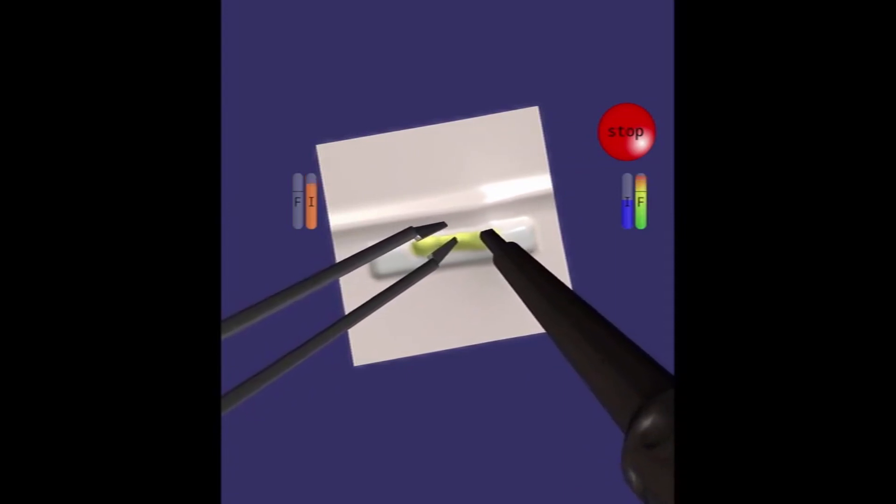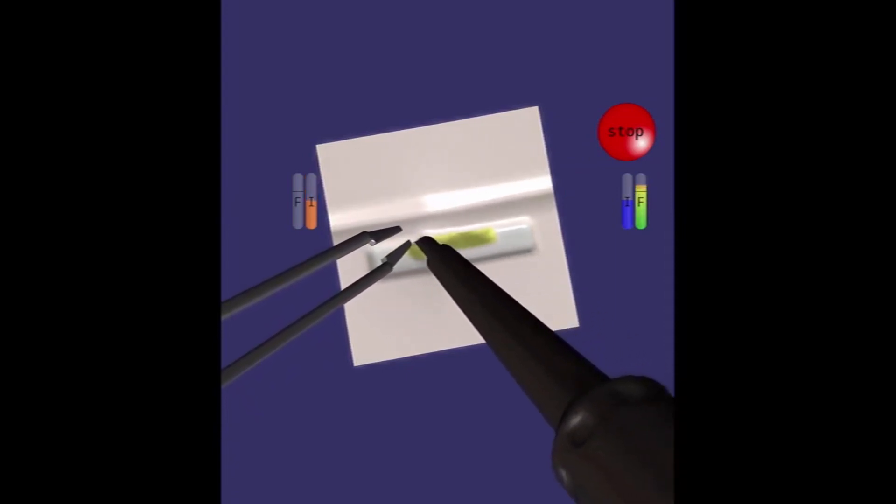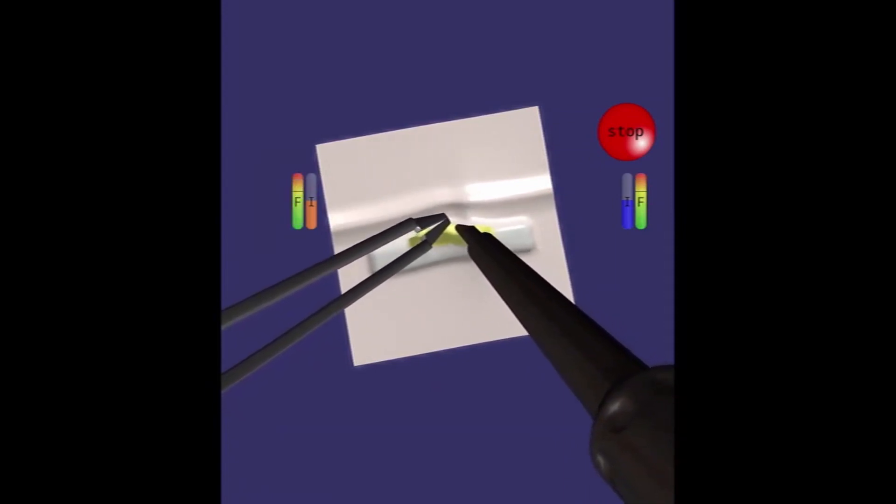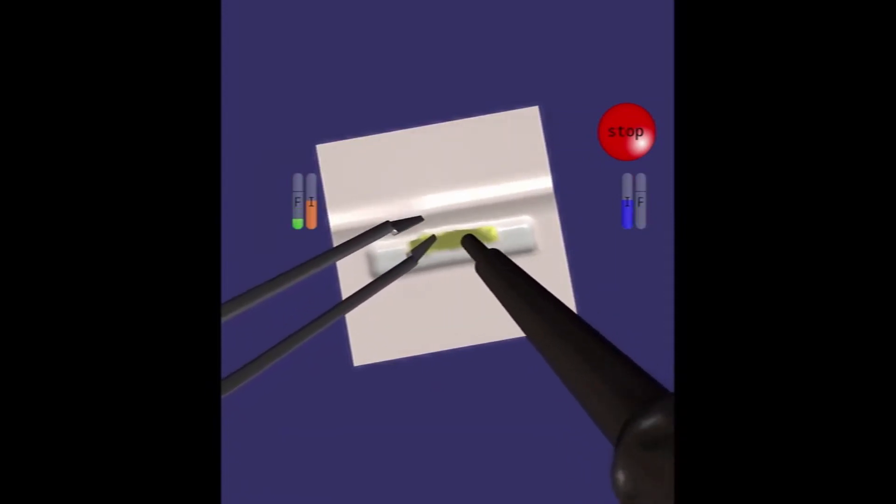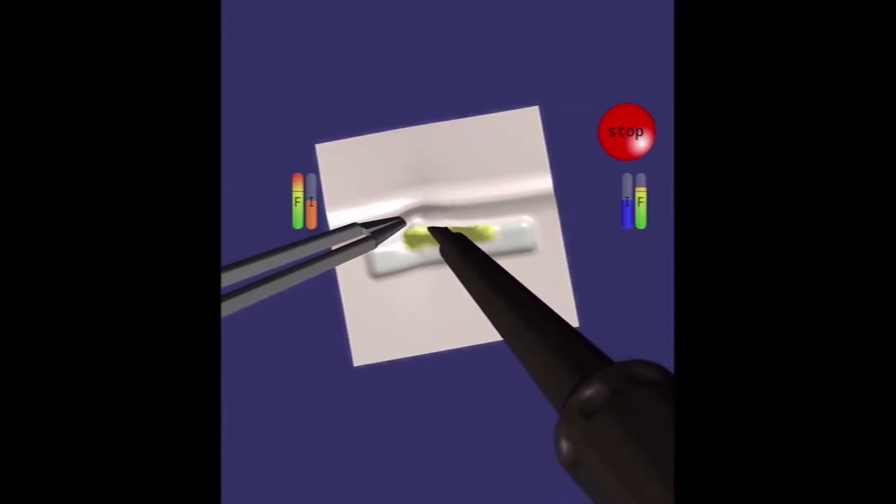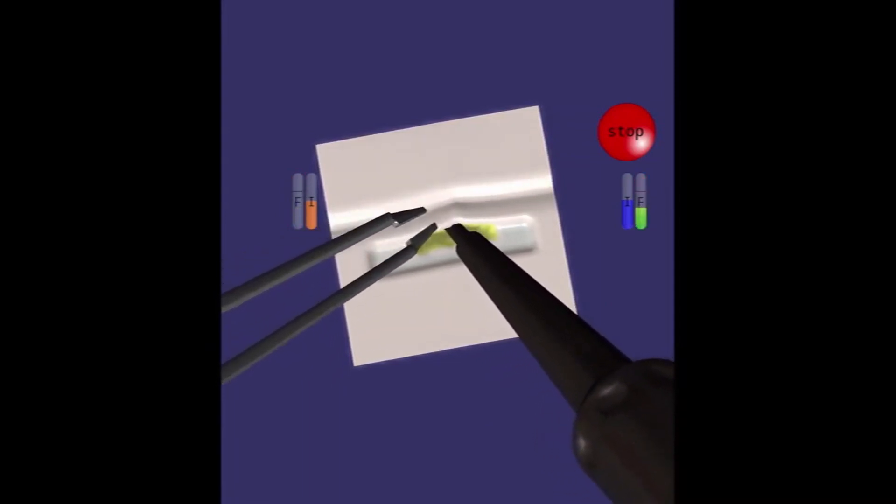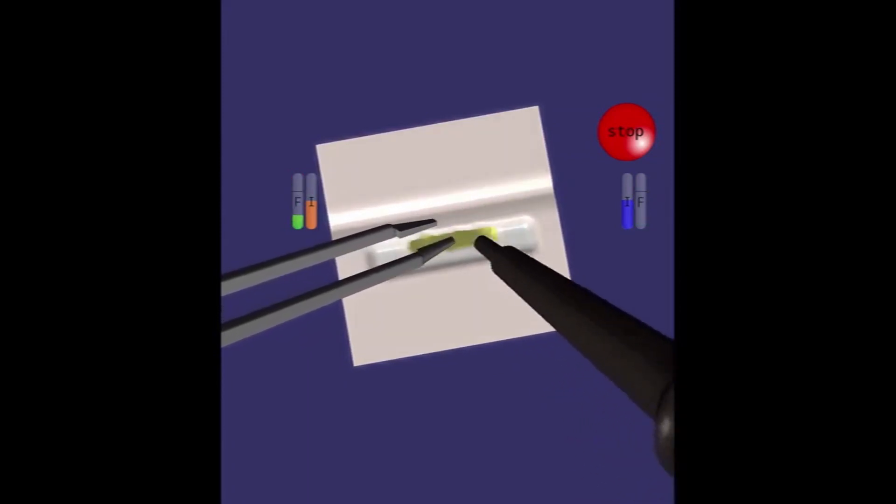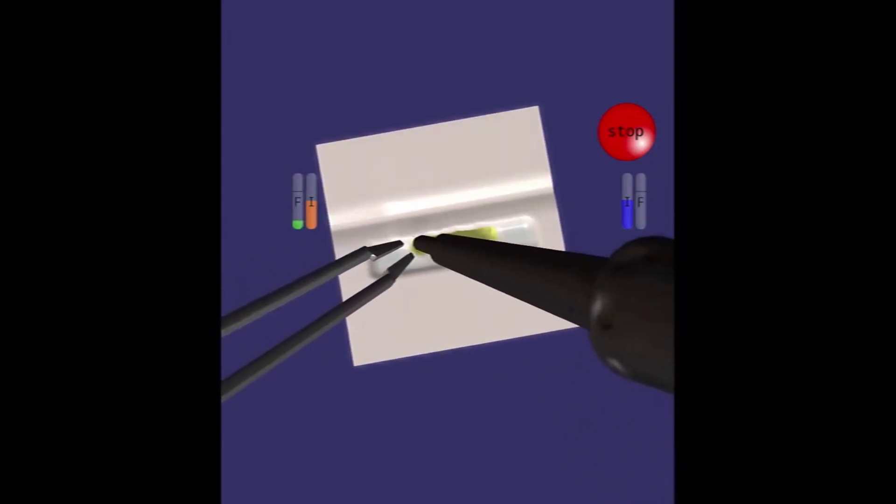Instruments used are a simulated bipolar forceps in the left hand and a simulated cavitron ultrasonic aspirator in the right hand. Both instruments are activated with a corresponding foot pedal. The two bars on either side of the field of view correspond to the intensity of the instrument's activation and the force applied by that instrument.